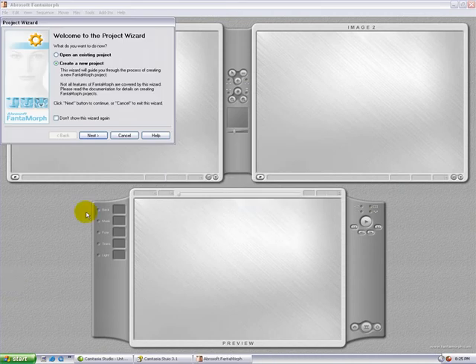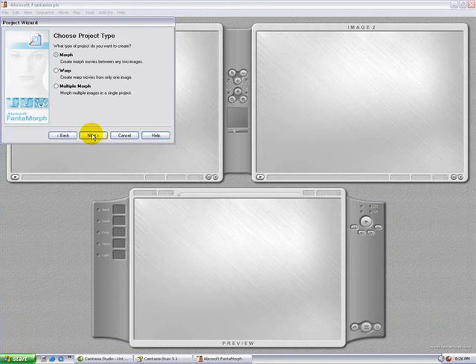Start with the new project wizard. Choose to create a new project. In this case, we'll choose morph.